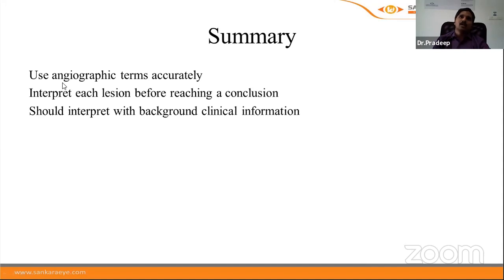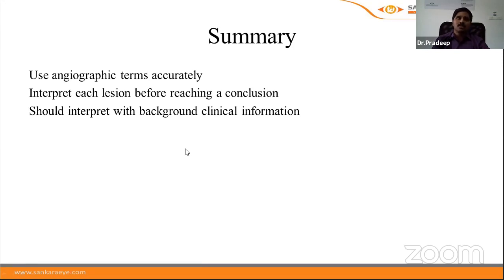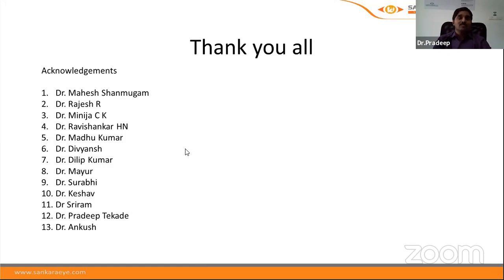To summarize: always use specific angiographic terms. Interpret each lesion before reaching a conclusion — in a complex condition like diabetic retinopathy, interpret each lesion separately. Always interpret imaging with background clinical information. This was a broad overview; the technique of performing angiography, side effects of sodium fluorescein, and other details have not been covered — please review those independently.